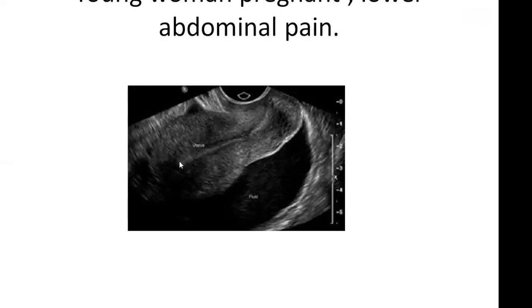Sometimes you can see the implanted fetus in parts of the serosa or in the tube, but I've seen three of these, and they were quite hypotensive, these patients. And I put it in here because it's extremely important. So a young woman with fluid in the pelvis, pregnancy positive, it's an ectopic until proven otherwise.